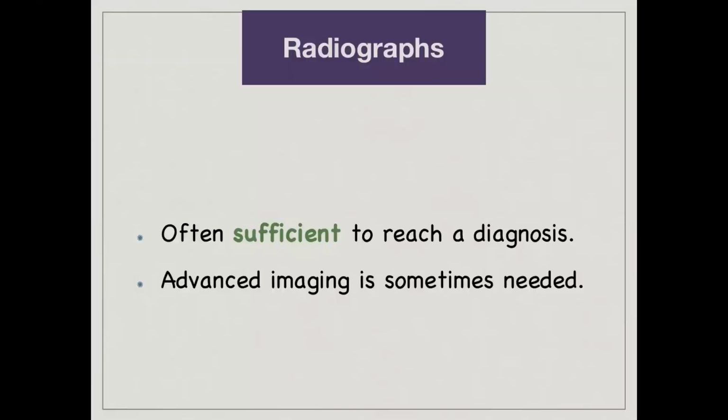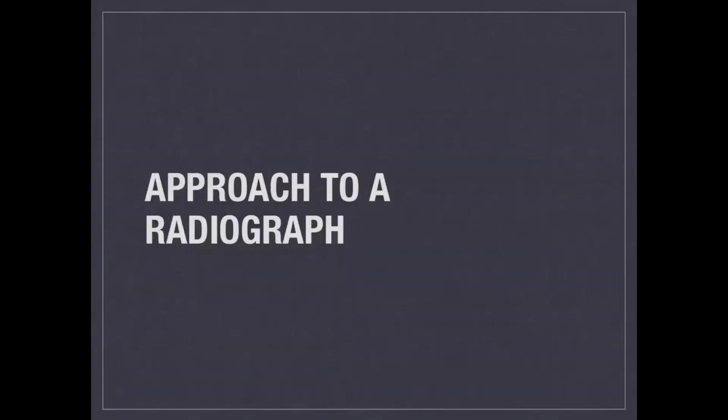I think these are some basics which are really important for us to go forward. So if you talk about bone tumors, the first thing which everyone needs to understand is that radiographs form the basis of bone tumors. If you want to see any imaging, radiographs is a must. So you should always start with radiographs, right? Sometimes even on radiographs alone, you will come to a diagnosis and you might not need any further imaging in certain cases. But you may need further imaging, which would be an MRI or a CT, depending upon the case. That doesn't let you ignore the radiograph. So radiograph is the most important modality for investigation.